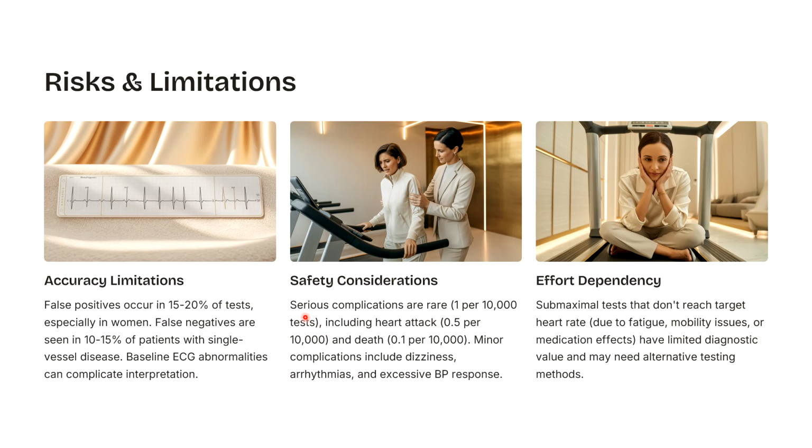Safety considerations. Serious complications are rare, 1 per 10,000 cases, including heart attack, death, etc. Minor complications include dizziness, arrhythmia, excessive BP response. So these are the safety considerations which we have to consider. Effort dependency. A submaximal test doesn't reach the target heart rate due to fatigue, mobility issues, or medication effects, or the patient may not want to give the total effort to complete the test. So these are the risks and the limitations of the TMT.